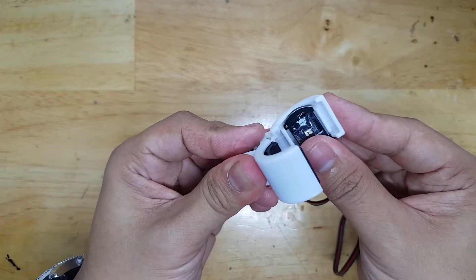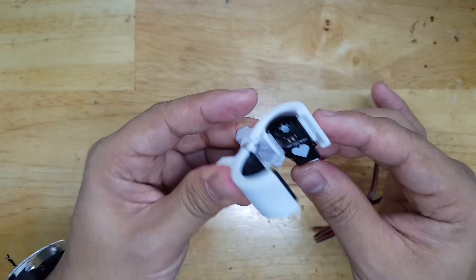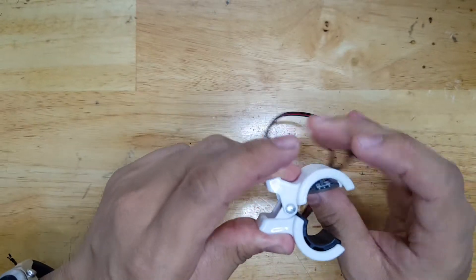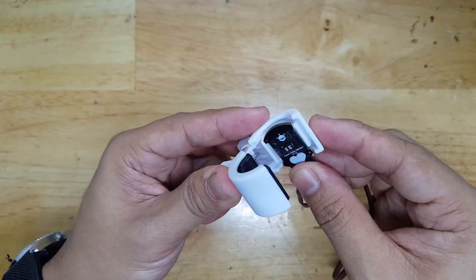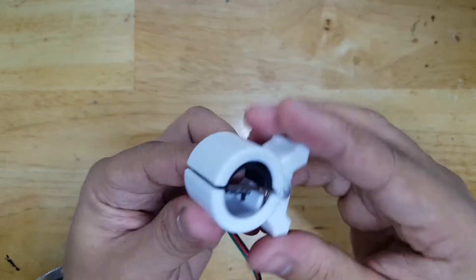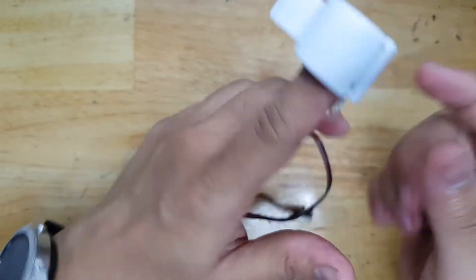I don't need to put any kind of temporary sticky blue tack there to fit it. I just need to put some more hot melt glue here so that it can be fixed. And then I just put my finger like this. Then it should be a perfect fit.